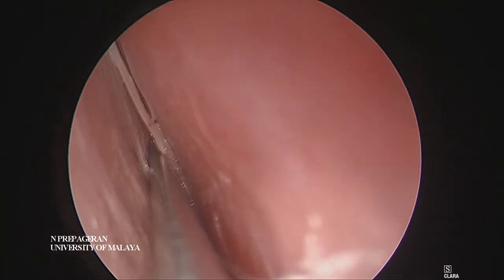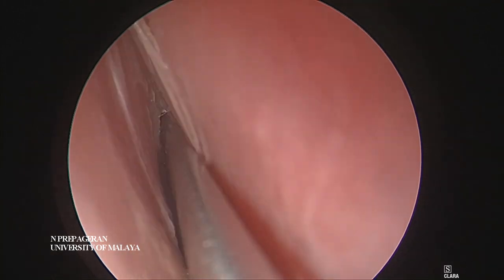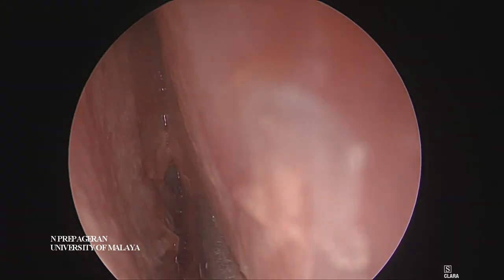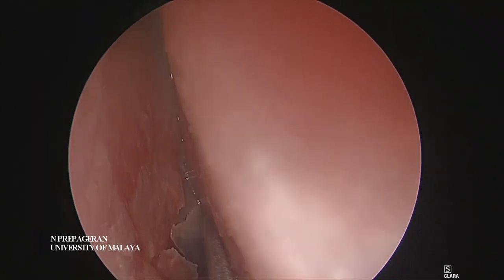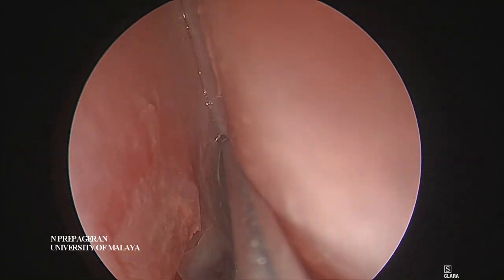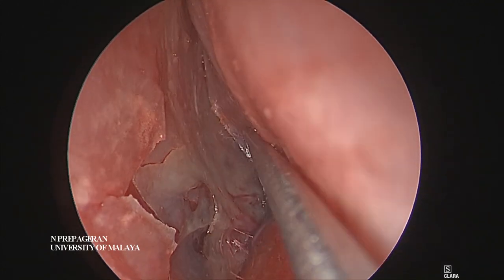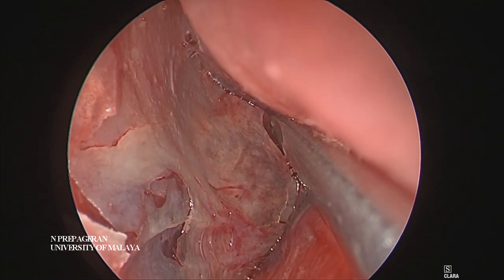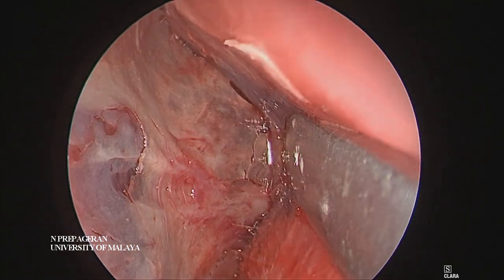It's quite a badly deviated septum and we should be able to identify the keel very soon. There - that's the keel coming into view. Can you guys see that? And here is the sphenoid ostia. So by doing this you can see the keel on this side already.